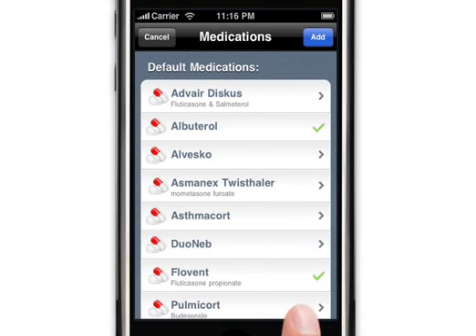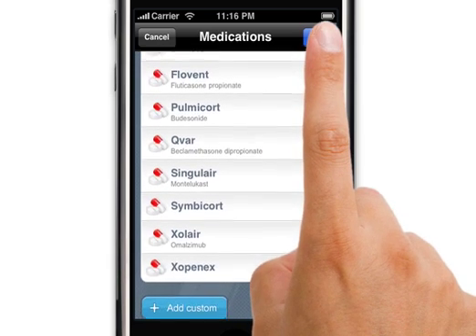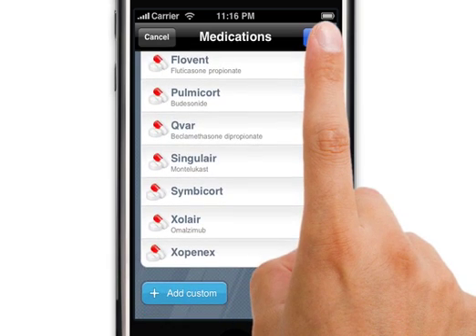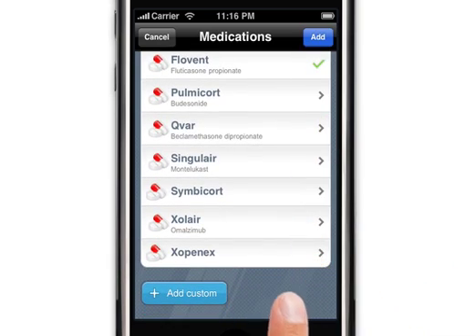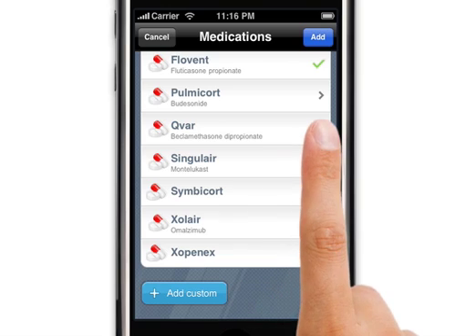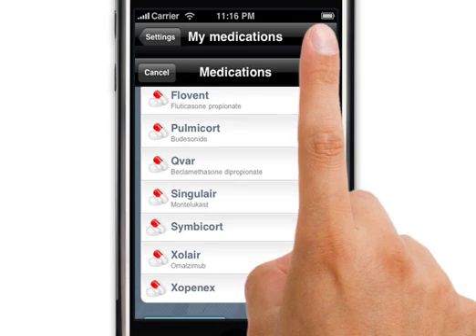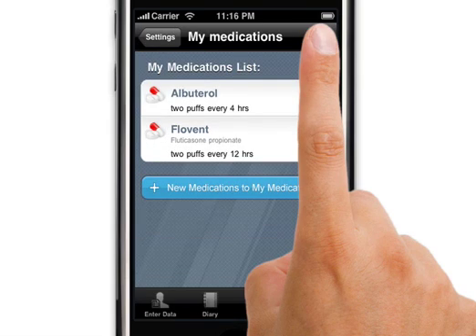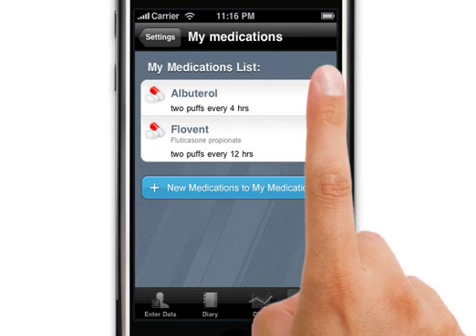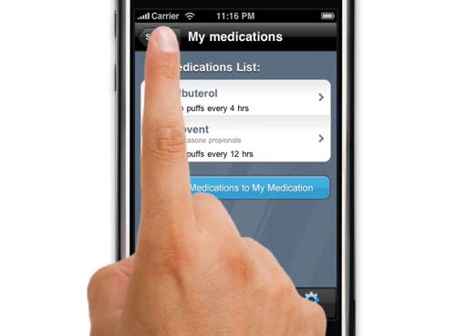And at the end, by pressing Add, the medication list will appear. From now on, you don't have to repeat entering these medications.